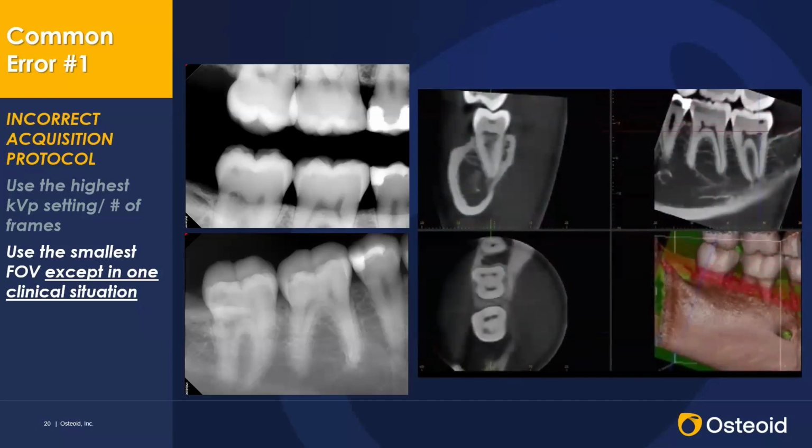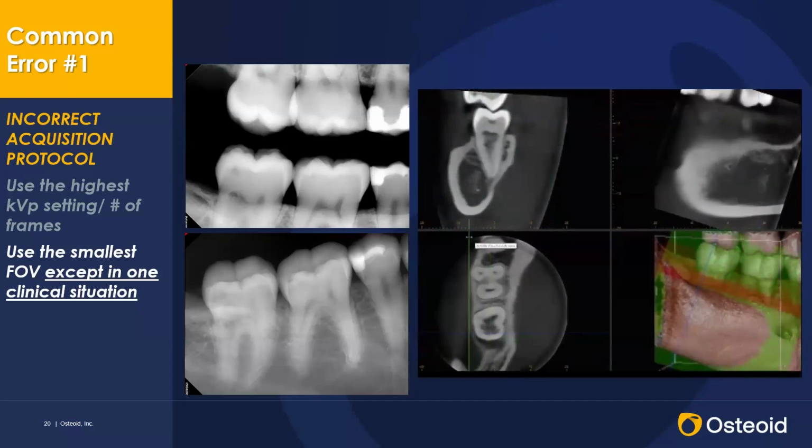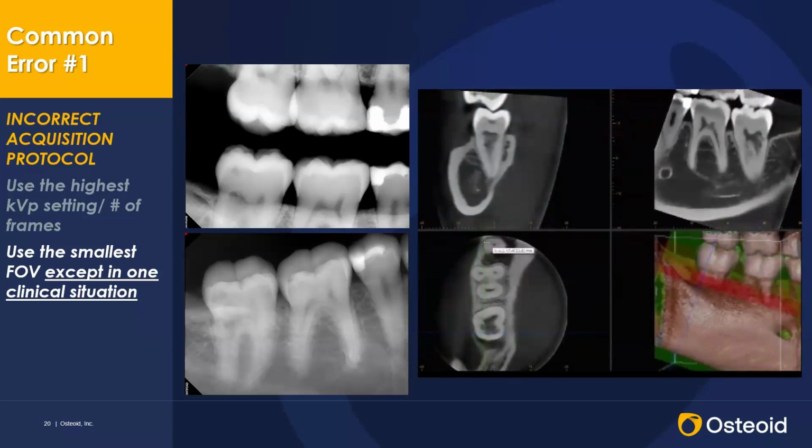Please excuse it, it is actually flipped, so it looks like it's the left-hand side rather than the right. And what we can see very clearly on the most distal tooth, where you have it magnified, is that there's external root resorption on the distal aspect of that tooth. There's also, which is what we saw, a carious lesion immediately inferior to the enamel. We can see that on the cross-sectional image on the top left cone beam CT pane, but there is a very large area of external root resorption and widening of the distal aspect of the PDL associated with this tooth.